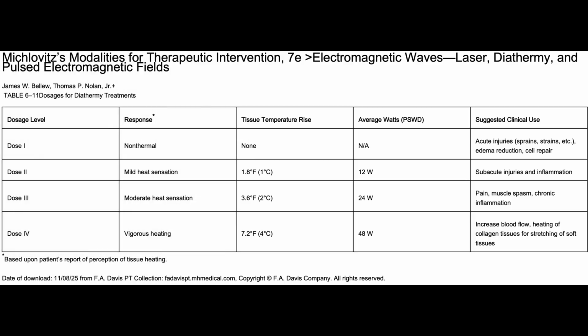The usage of this type of modality is indicated when needing to heat deeper tissues, heat a larger area of tissues, has less risk of burning soft tissues than conductive methods, improve joint or soft tissue mobility, reduce pain in OA, sprains, and PID, and using it when the patient has shingles virus.